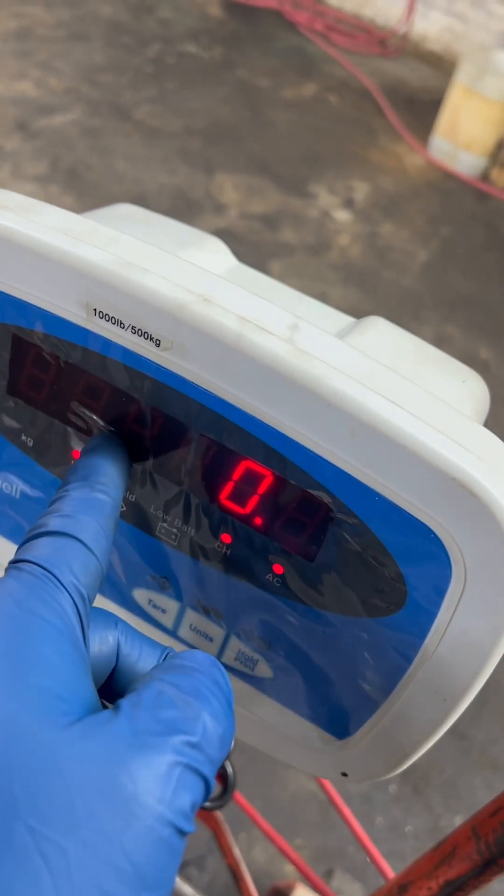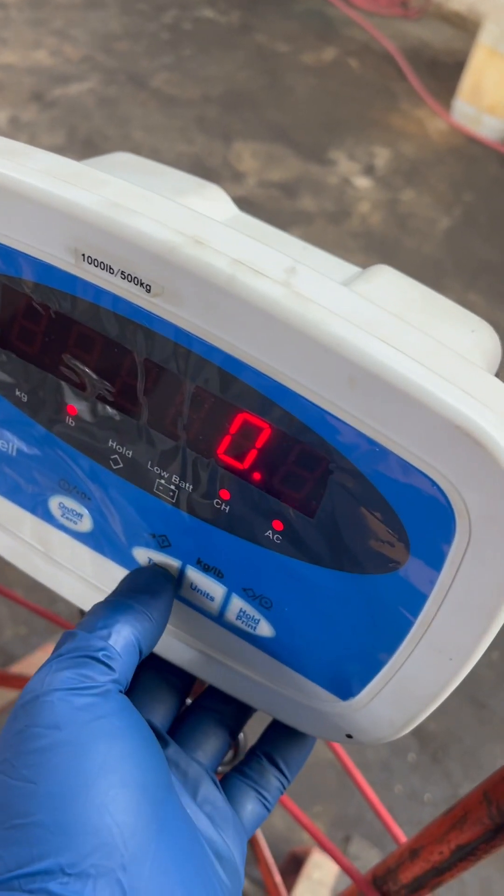Okay, so at this point, this is the first point. You do a cal zero with no weight on the scale. Hit the tare.